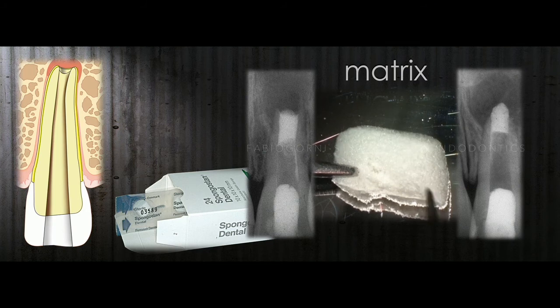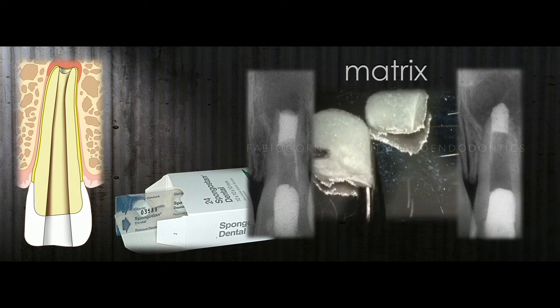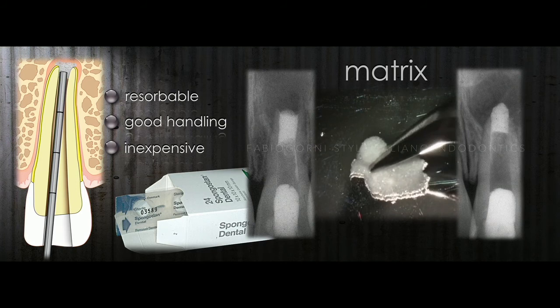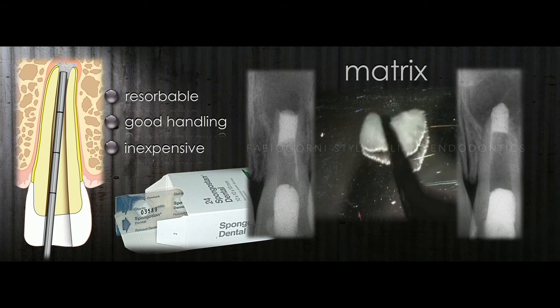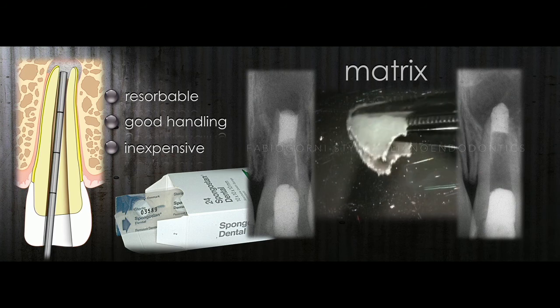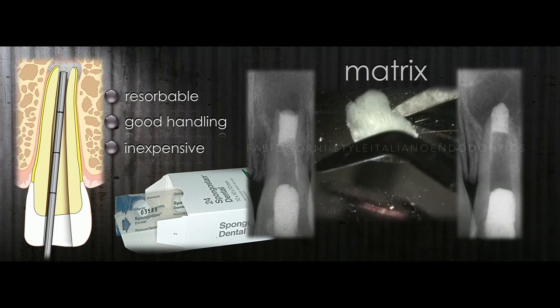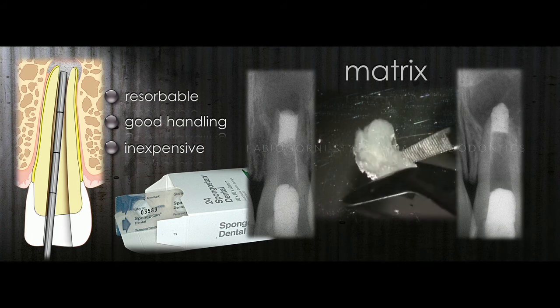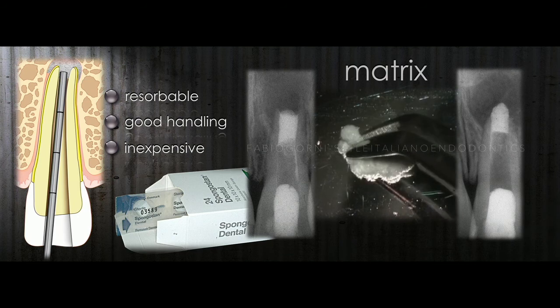Also in the large foramen, the use of the matrix is one of the most important steps of the treatment. It's really important that the material that we will use must be resorbable, with a good handling, and if possible, inexpensive. In the left case, we can see the after of the barrier that is completely changed compared to the case on your right, where we didn't use the barrier.